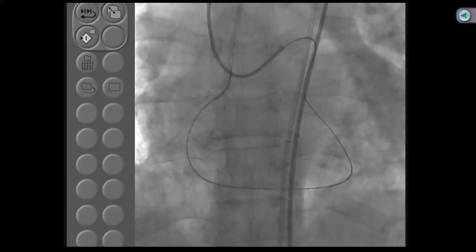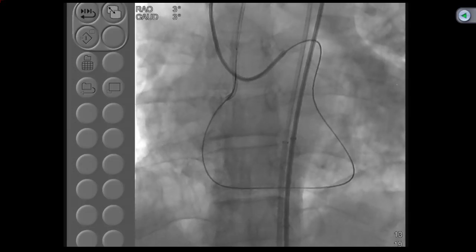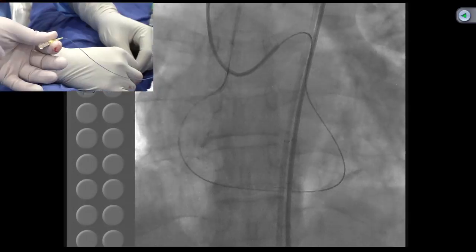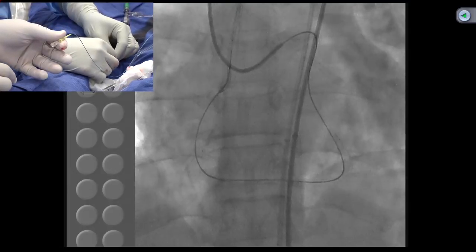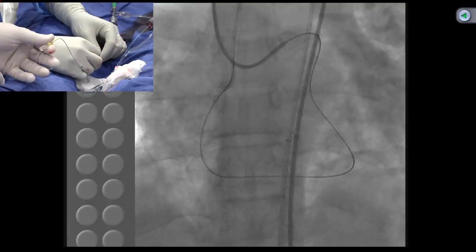Now see, I'm going to go Cine. Fine cross has reached there, but we don't have the wire out here. Almost reaching it. Advance a little bit. Keep advancing. A little bit, not much. Now what we can do actually is I'm going to start pulling the Corsair back so you can start getting the fine cross ahead, okay?